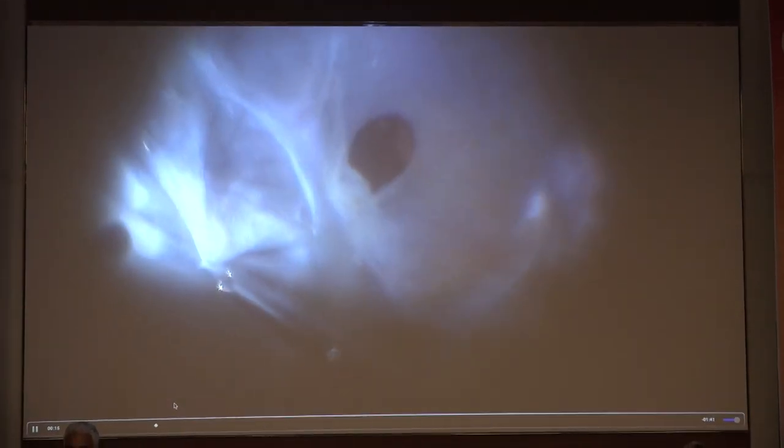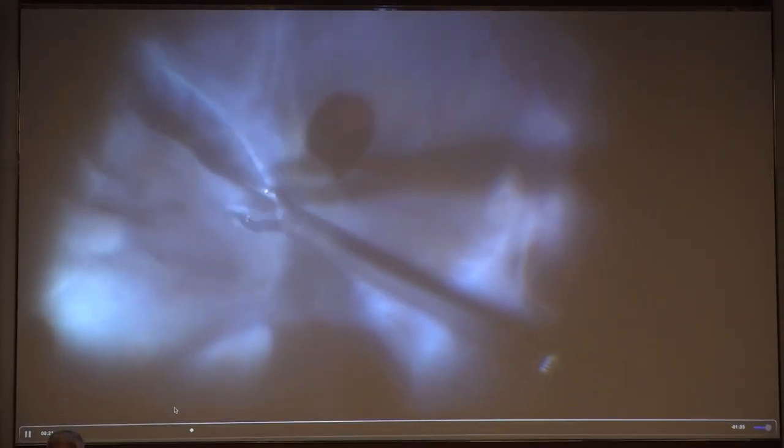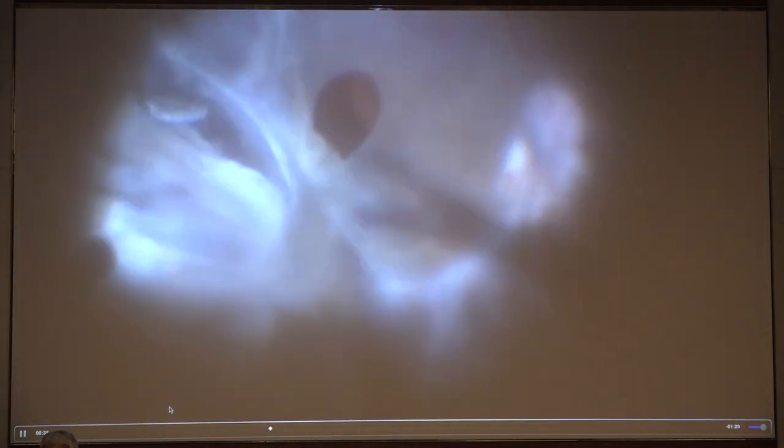So lot of membranes around the macular hole, and lot of PVR changes all around the macula. It was previously a combined retinal detachment, and due to the boggy macula, secondary macular hole formation happened. So I tried to remove all the membranes, and the retina was very friable, so it should be very gentle to remove the membranes only, not to create any secondary breaks. But the membranes were quite tightly adhered.